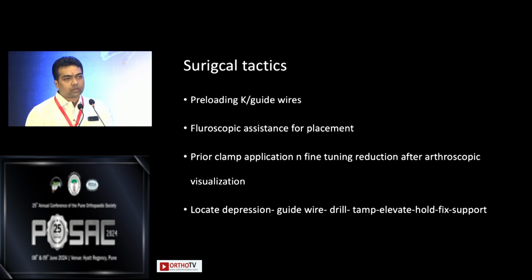So the surgical tactics while fixing these fractures are that, as we are using more than one system to manage these fractures, we are relying on open or percutaneous fixation of these fragments with screws or plates, using arthroscopy, along with fluoroscopy. Therefore we are juggling more and more instruments during the surgery. Therefore, we need to stick to time.